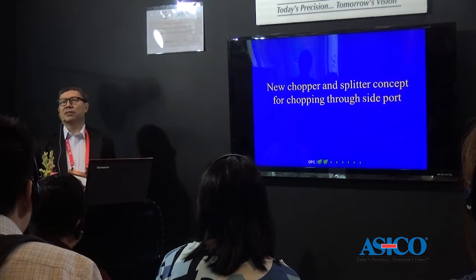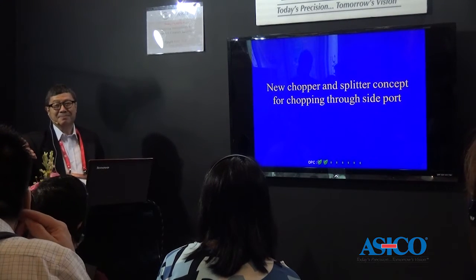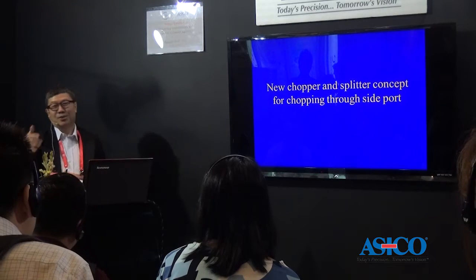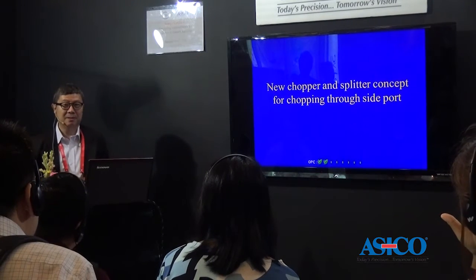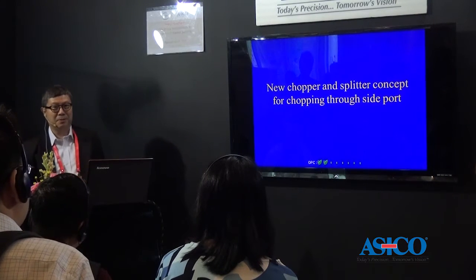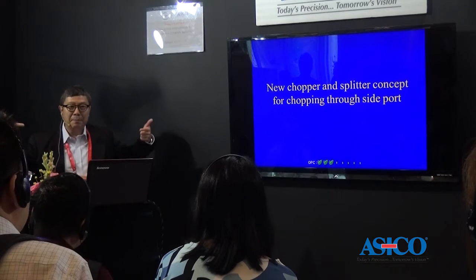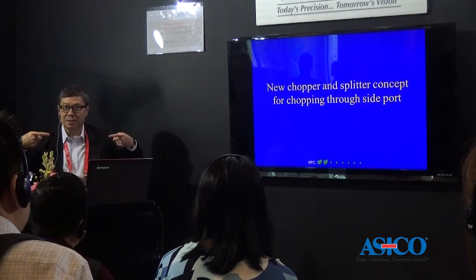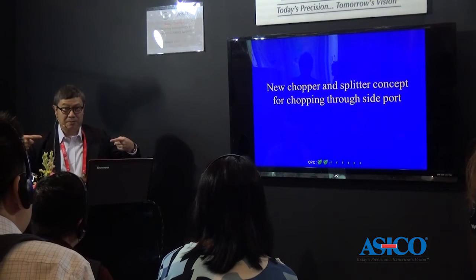Now, how big is your side port? Do you know how big your side port is? You're not sure, right? I mean, we all make a side port. We poke a knife in. Is it 1? Is it 0.5? Is it 1.5? You're not sure. All I know is that if you're a bimanual IA person, your incisions are at least 1.2, if not 1.4.